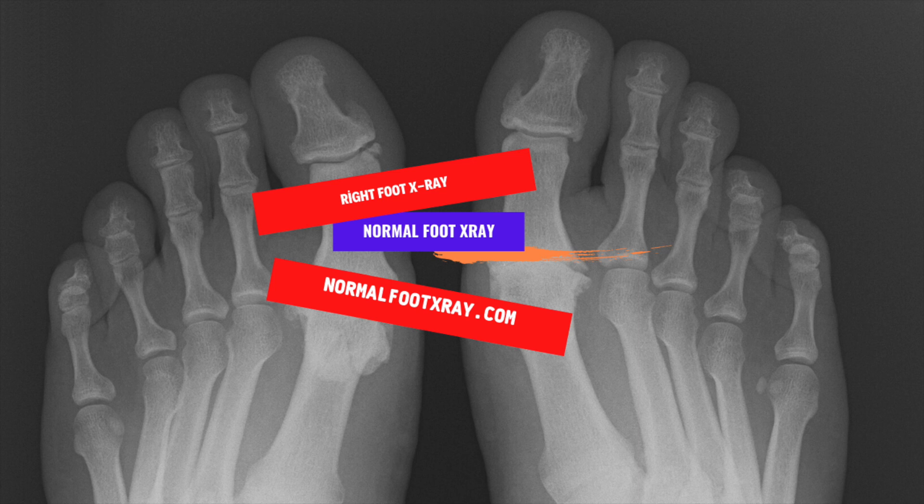A patient should be prepared to sit still and be calm during the procedure. The image shows the bones and soft tissues of the foot. The x-ray film captures the image in black and white — dense structures show up as white while softer tissues appear darker. The patient will be exposed to radiation for only a few seconds and the test will take approximately 15 to 20 minutes.